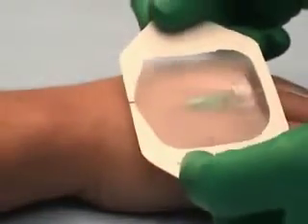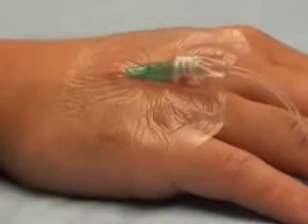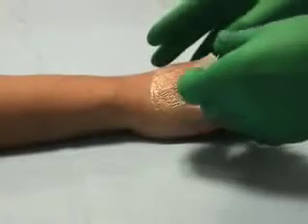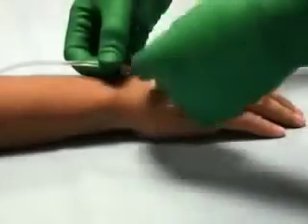Ideally, you should secure the cannula with a transparent occlusive dressing placed over the cannula hub. Confirm that the hub of the cannula is clearly visible through the dressing to facilitate monitoring. After securing the cannula with tape, loop the intravenous tubing and secure it away from the insertion site.